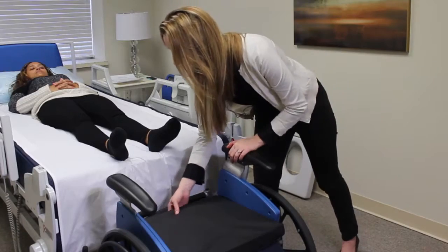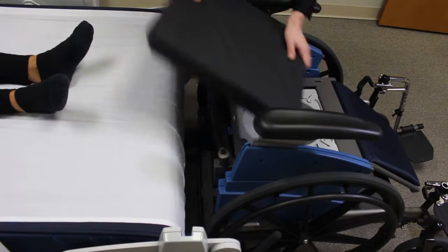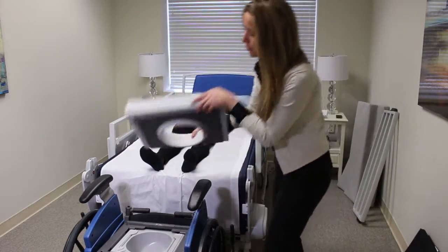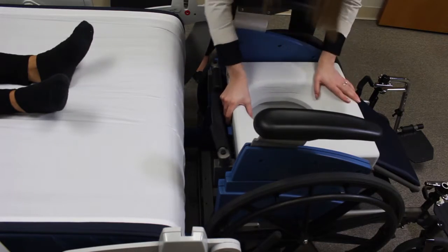You then press the blue lever on the seat to remove the cushion, and then you put the commode cushion on and make sure that the hooks go into the seat and click down.